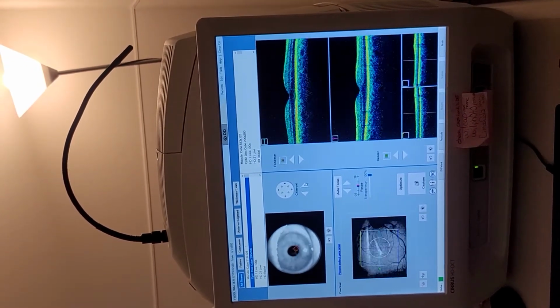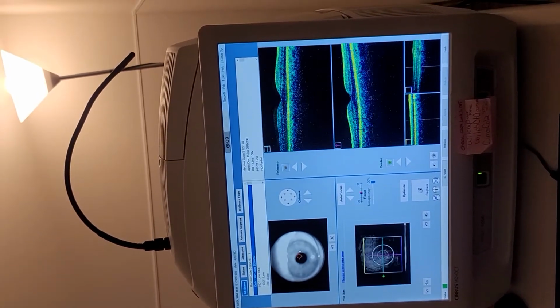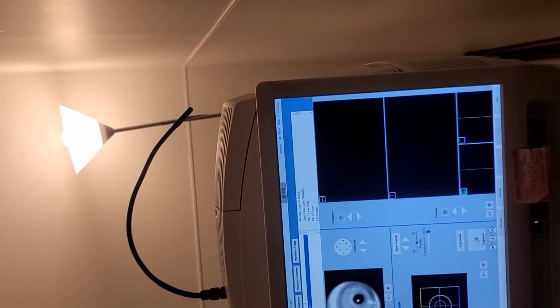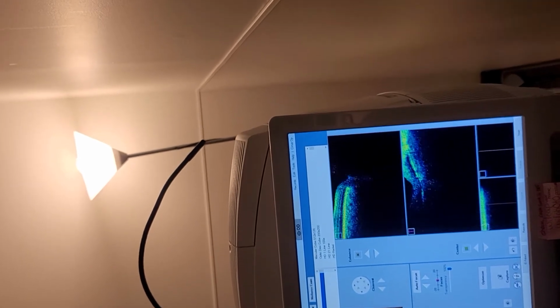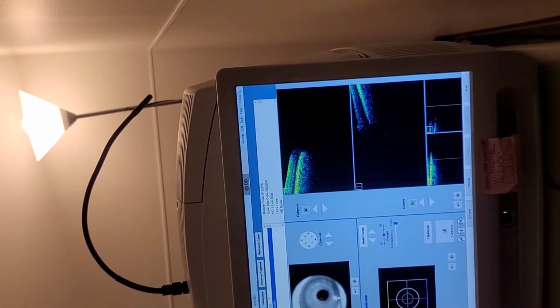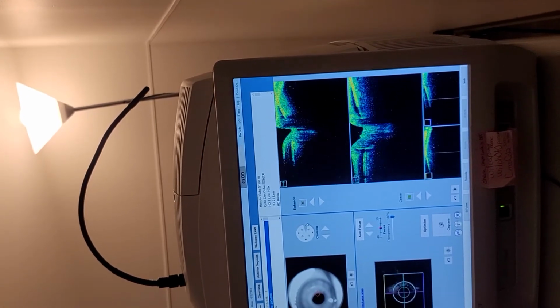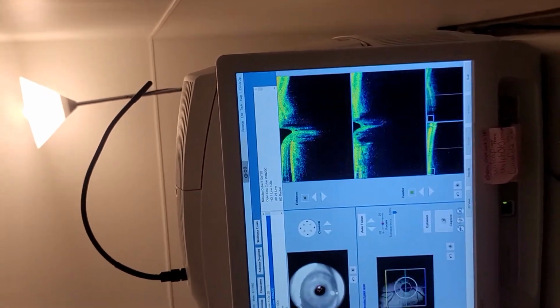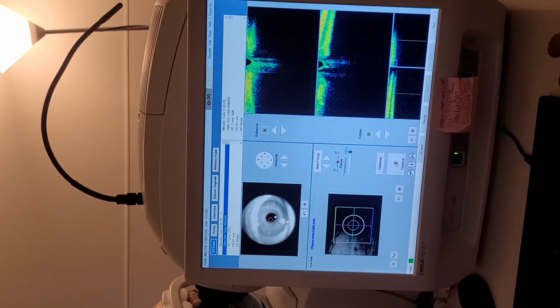Right now there's just so much going on, it's a lot. Okay, just focus on what you're doing. Focus to the green star. Now, where's the green star? Green star is left side. Ask him, and then you read the right. Actually, you need to tell him left side, where he should look, because he's going to look where we say, and it might not be where we repair. So the green star was to his left, good.